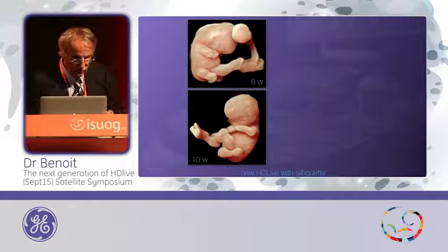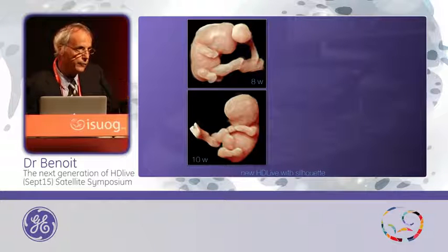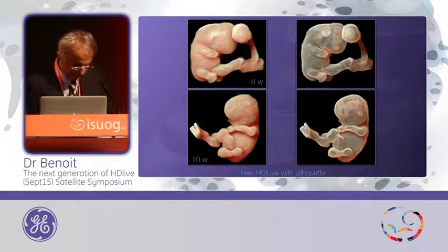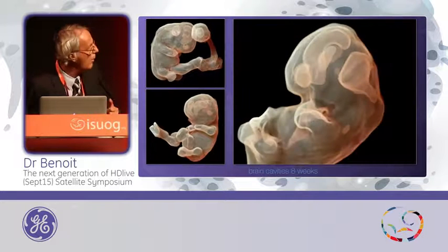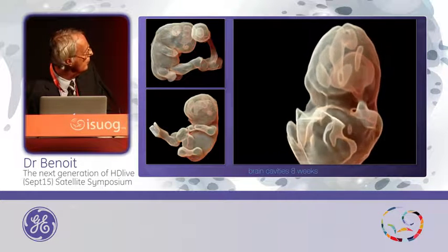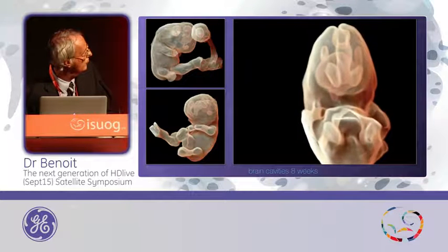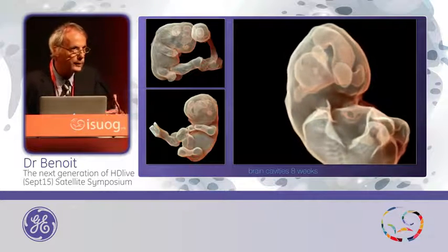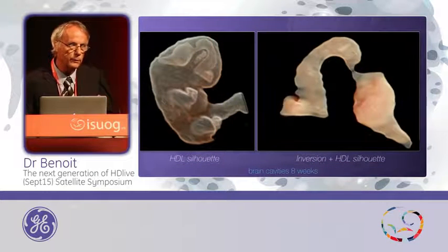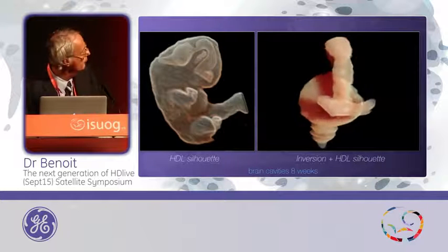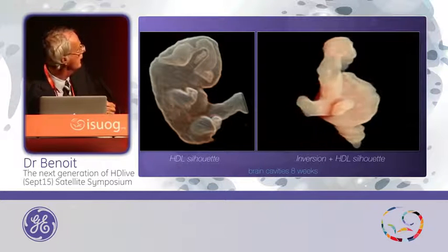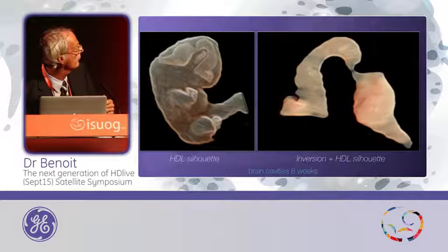You can see embryos at 8 weeks and 10 weeks of pregnancy when the level of silhouette is low. Now we will increase the level of silhouette and you can see inside the brain cavities clearly. This is an eight-week embryo with the brain cavities — the two lateral ventricles on the anterior part and the rhombencephalon on the posterior part. This is quite easy to obtain and you don't have to use a magic cut. With this mode, you can clearly first choose the silhouette, then cut exactly and extract the brain vesicles.